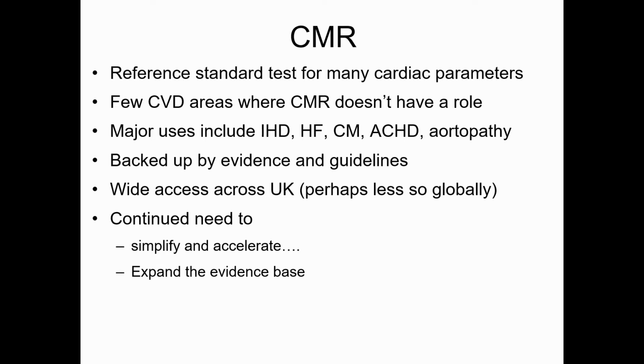There is wide access to CMR across the UK. I think we've got 80 or so centres out of the 128 acute trusts in the UK that have a CMR service. So most hospitals have access to it. Perhaps we're very lucky in the UK. I think we've got more access to CMR than the whole of the US. In fact, we do more CMR scans in the UK, I think, than the entire US. So we are lucky in that situation.